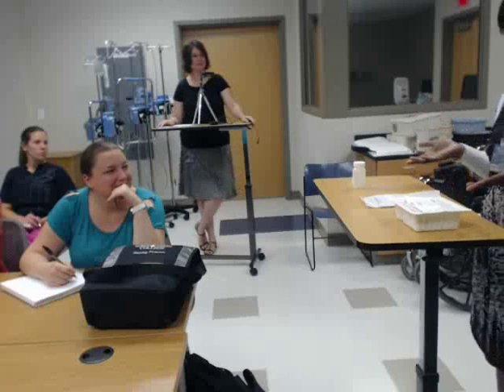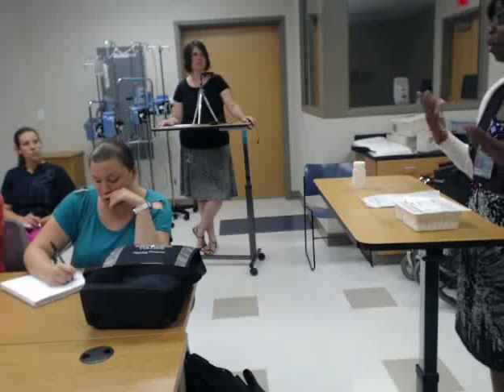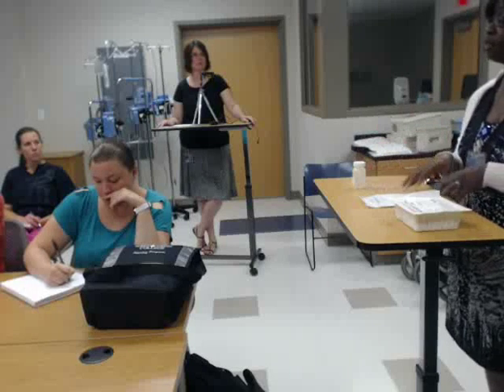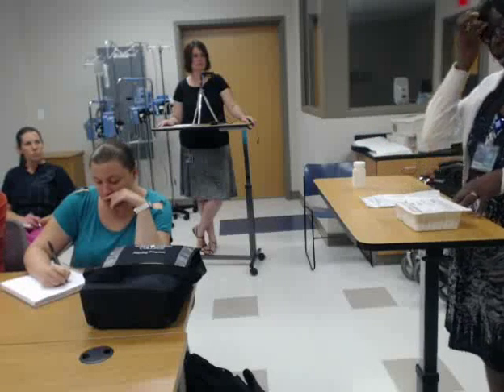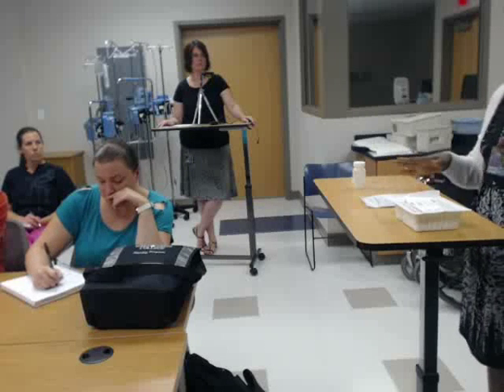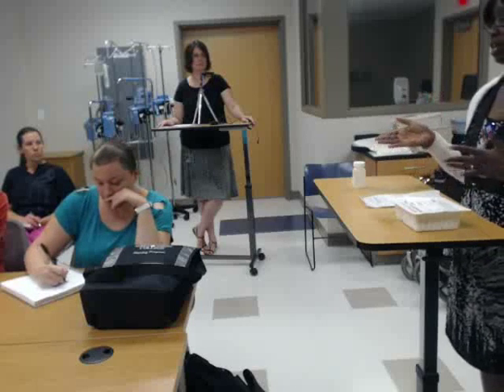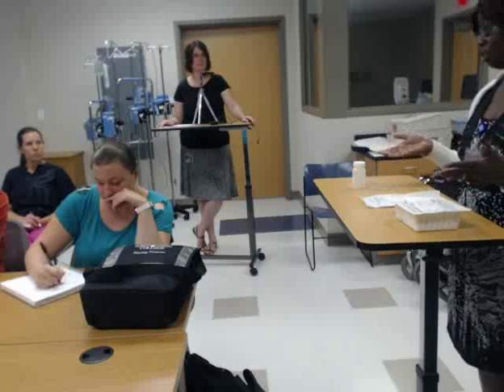To start out, just to talk about a couple of principles first. When you're setting up your sterile field, before you go in the patient's room, you want to gather all your supplies. Make sure you have everything for your procedure first. Then you want to clear the bedside table off, wipe it down with a sani wipe, let that dry, and then start setting up your sterile field before you start your procedure.